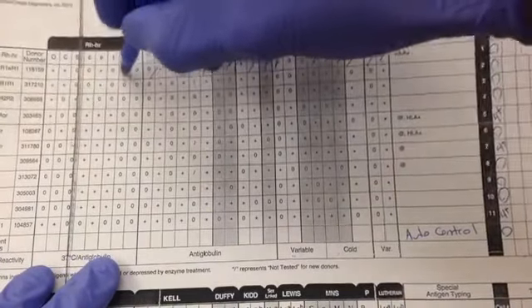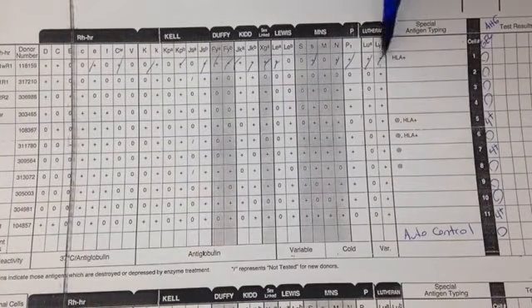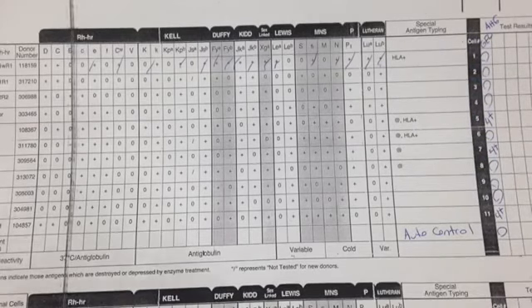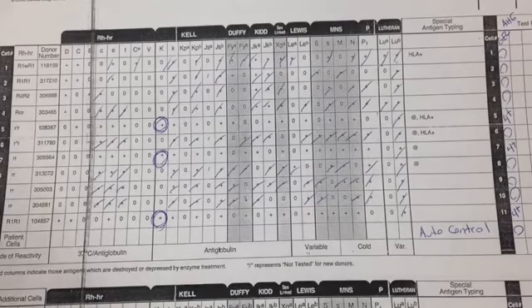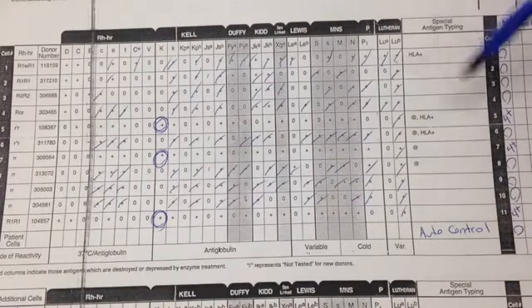So what I'm doing now is, if you have a 0 reaction, you would go through that cell and you would mark out all the positive antigens, because if you're getting a 0 reaction for that cell, then anything that's positive it can't be, essentially. So here I just went ahead and filled out all the little cross-outs. Not everybody does this. I certainly don't anymore go to this extreme.